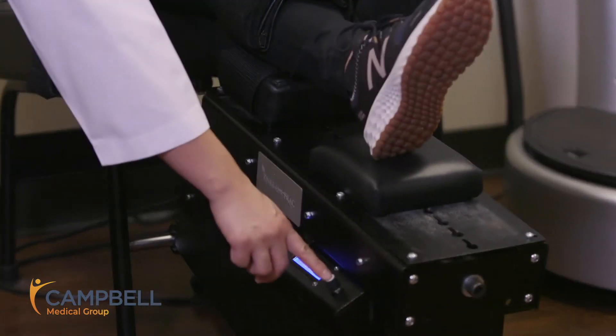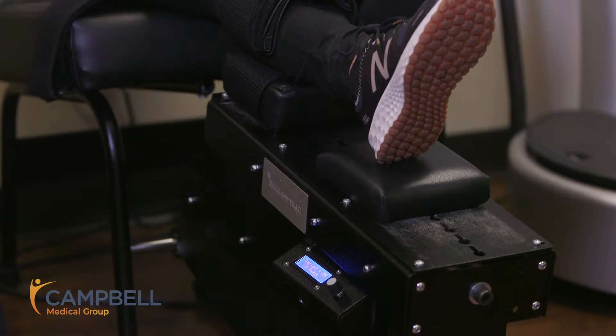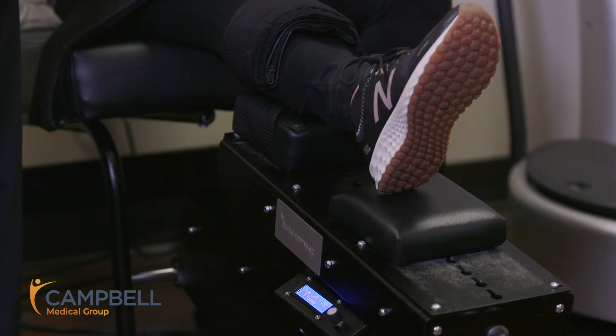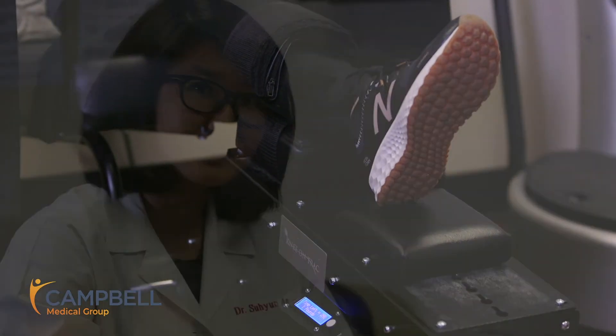Typically, this therapy is not performed alone. We would inject PRP or stem cell into her knees, and it's a very simple procedure. The machine is already set, and as you can see, the computerized motor is distracting her knees over a period of time. It feels very good — patients mostly enjoy the stretchy feeling or the decompressive feeling that they get over their knees.